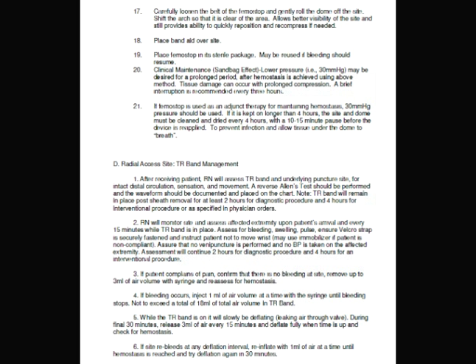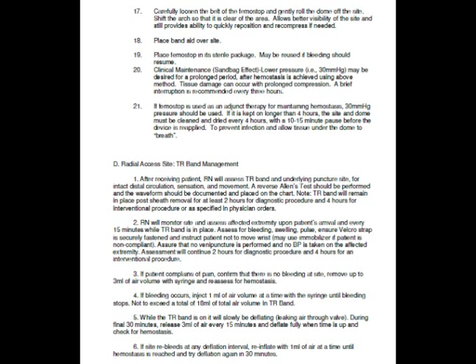Okay, so now back to our policy, the arterial sheath removal. And if you look at D here, it talks about your TR band management. RN will monitor site every 15 minutes. No blood pressure taken on the affected extremity. 2 hours for diagnostic procedure, 4 hours for interventional procedures.